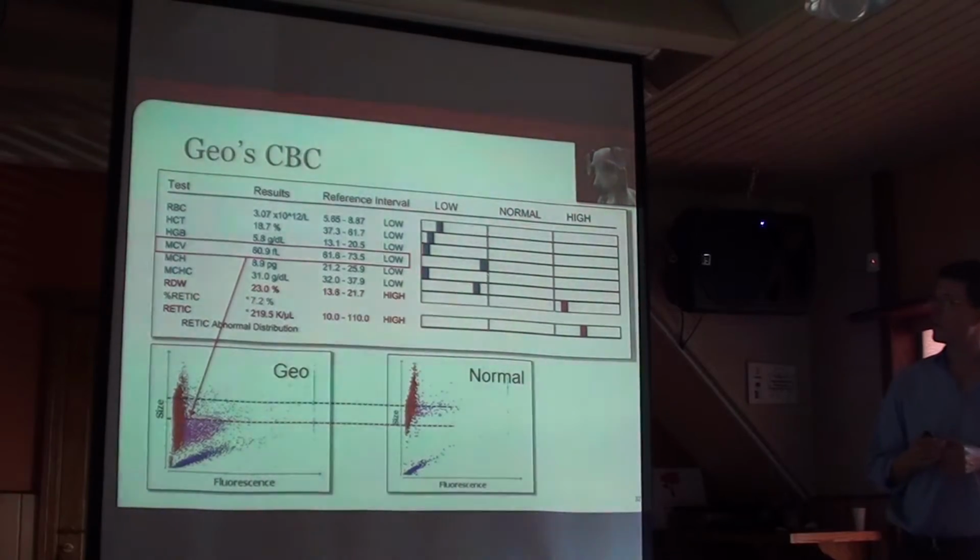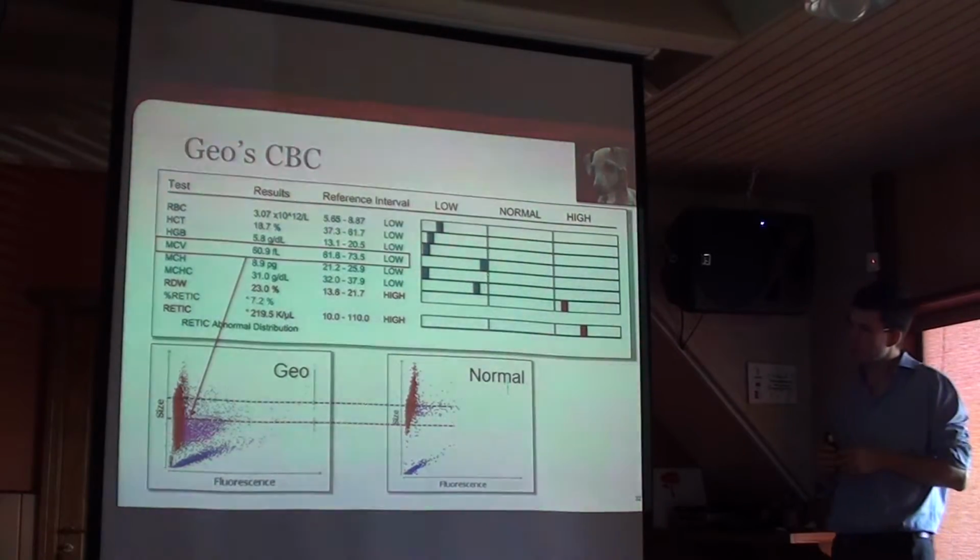So let us have a look at another patient here. This is a patient called Gio.